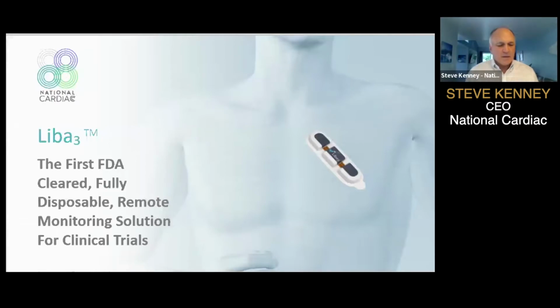So anyway, a brand new $20,000 EKG machine is provided to each site, and that could be anywhere from 20 to 200 sites across the US. A 1-minute EKG is taken when a subject or patient initially volunteers for the study. And then each week thereafter, when the patient comes back into the site for lab work and examination and the next week's dose of medication, once again, a 1-minute EKG reading is taken. This means that there's only 1 minute of cardiac data collected each week during the clinical trial.